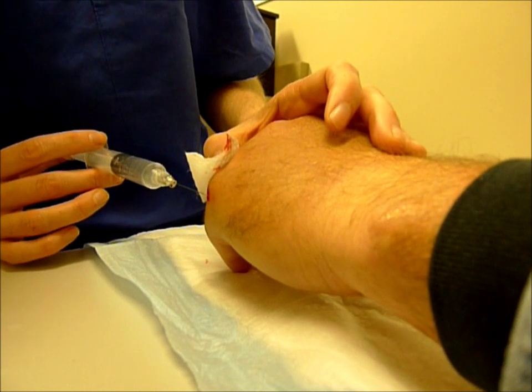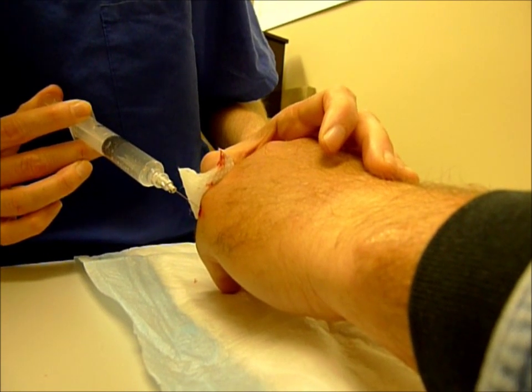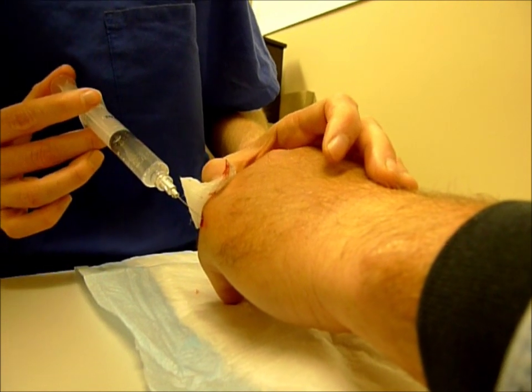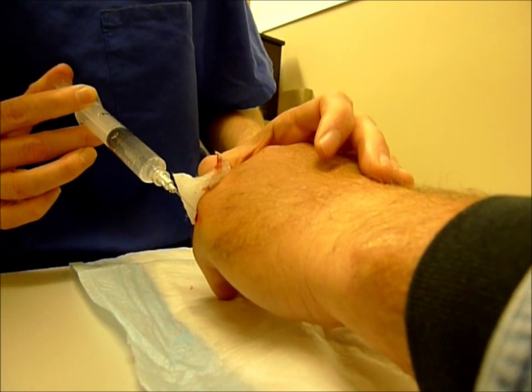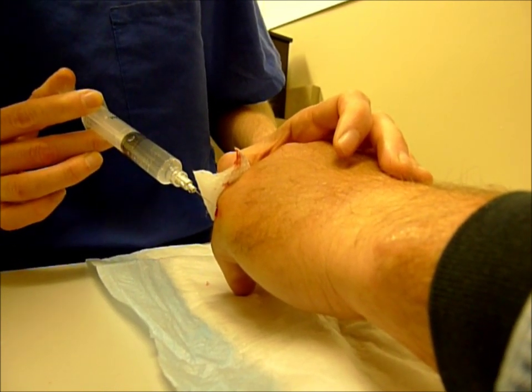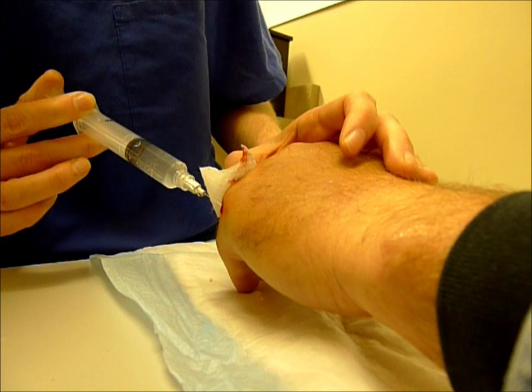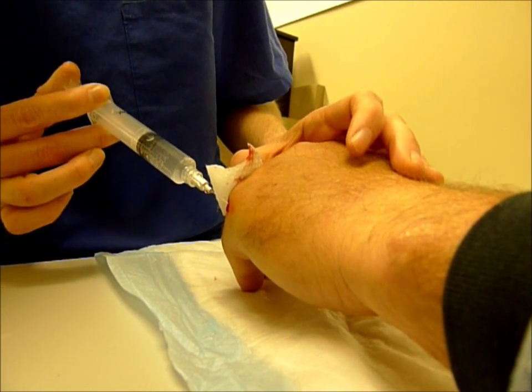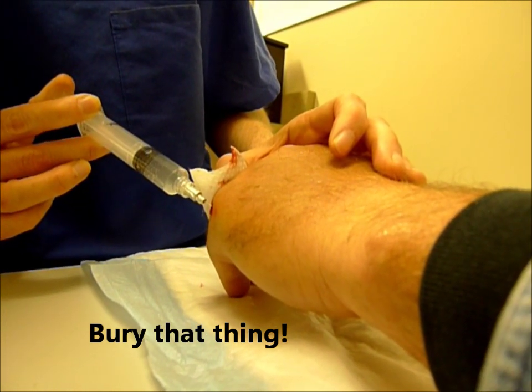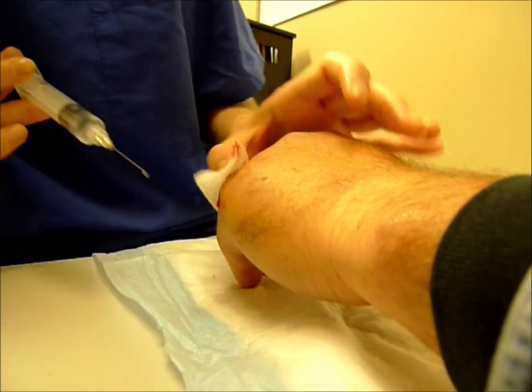How is this — is it numb here? Is that numb? Yeah. Relax your fingers — as relaxed as they're going to get. It helps if you relax your shoulder. There you go. She's almost done.